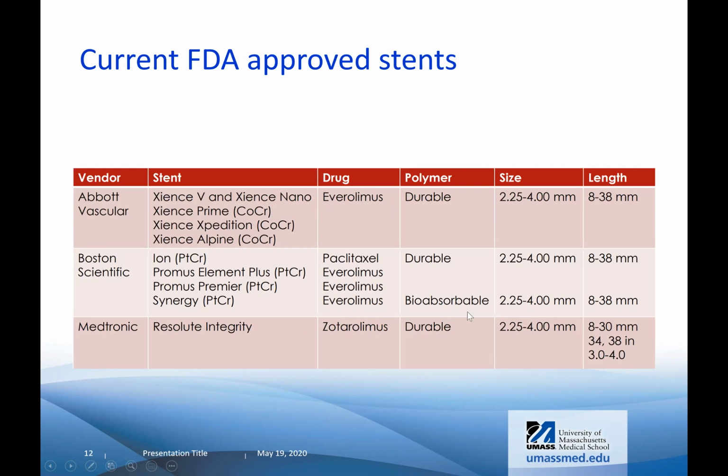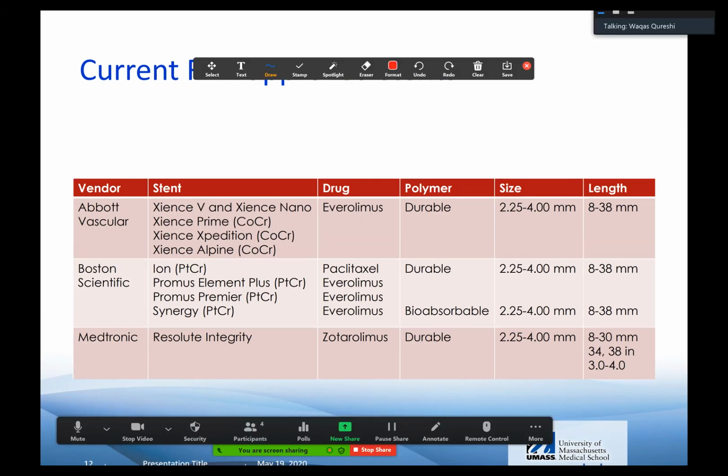And then there's something called polymer. I'm going to go over the structure of a stent. So what a stent is, let me go again on my drawing. You might have seen a stent something like this.